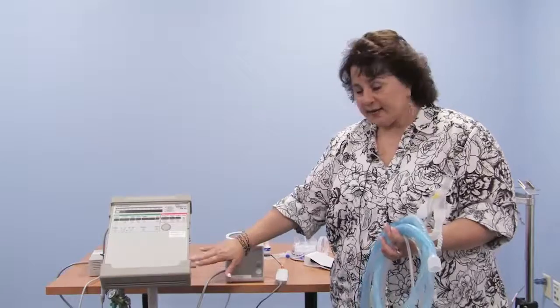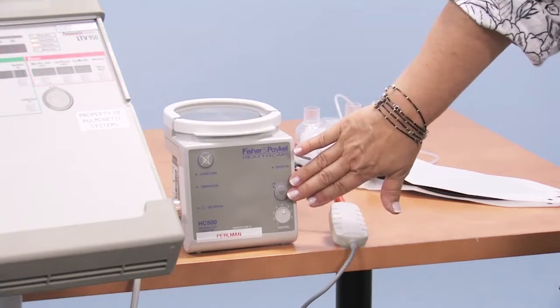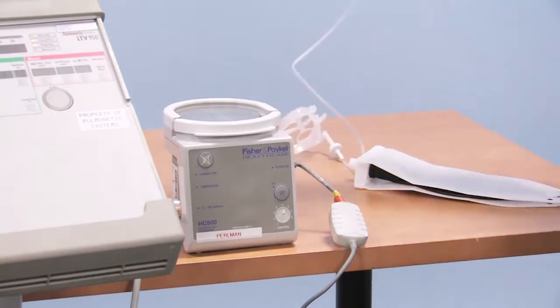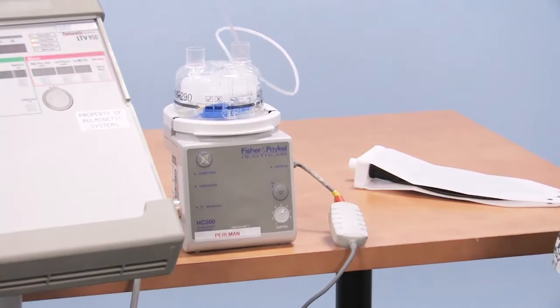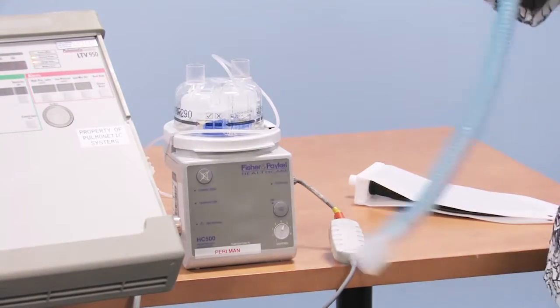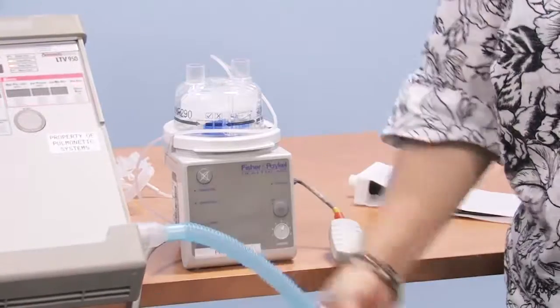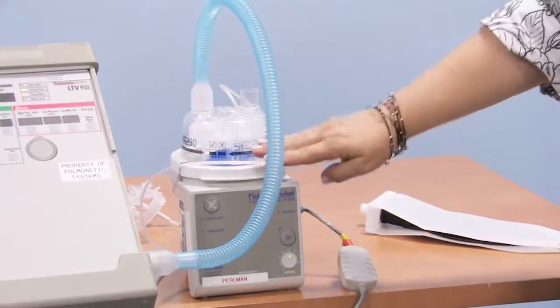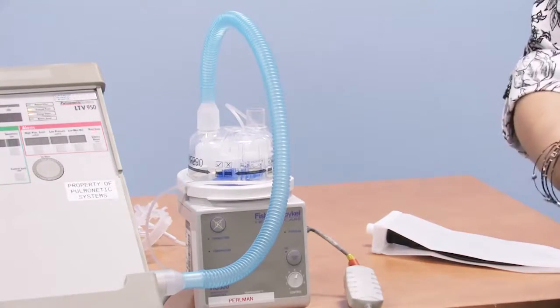What we need to do, because we're using the humidifier today with this 950, is get the cool and dry gas from the ventilator to our humidifier. This particular humidifier is the Fisher-Paykel 500. Your DME company may provide you with a different brand or model. This one uses a chamber on the top and connects to a sterile water bag. For ventilators with tracheostomy tubes, sterile water is recommended. So we need a piece of hose to get the air from the gas outlet to the humidifier, and they provide that for us. So we're going to connect those. So now the air from the ventilator is going to pass over warm, heated, sterile water, pick up moisture and heat to deliver to your child.